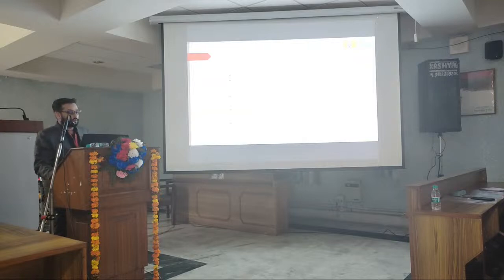And coming to the distant metastasis, that's the bone scan, 99m technetium bone scan. It's a highly sensitive conventional imaging technique. It has a sensitivity of 79% and a specificity of 82%. The incidence of bone metastasis increases substantially with rising PSA and upgrading Gleason score. So bone scan should be performed in symptomatic patients independent of PSA levels, grading or clinical stage.